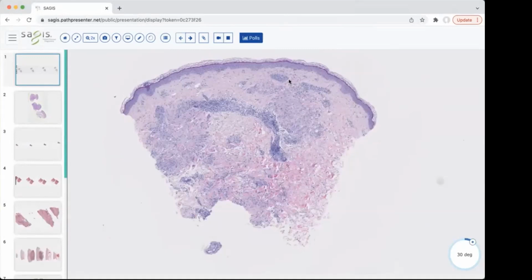The next is tuberculoid granulomatous dermatitis. Those are also nodules of histiocytes, but a little less well-defined than the perfectly circular sarcoidal granulomas. Usually they're rimmed by lymphocytes or some other inflammatory cells. They can have necrosis, but that's not a requirement. Next is palisading or collagenolytic or necrobiotic. I don't want to anger the Dermpath gods by using some of those terms, but I actually think that necrobiotic can be a useful term for comprehending those.